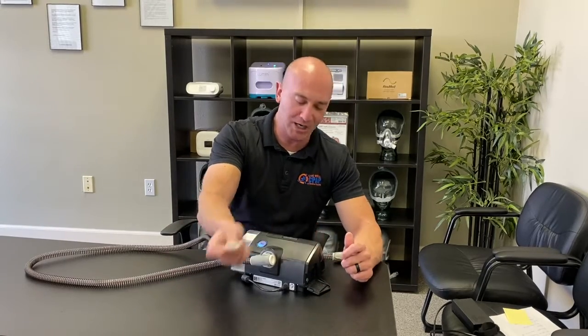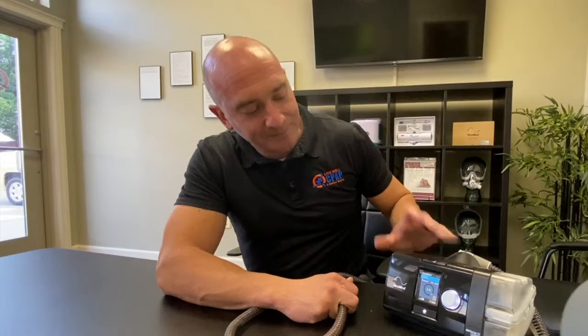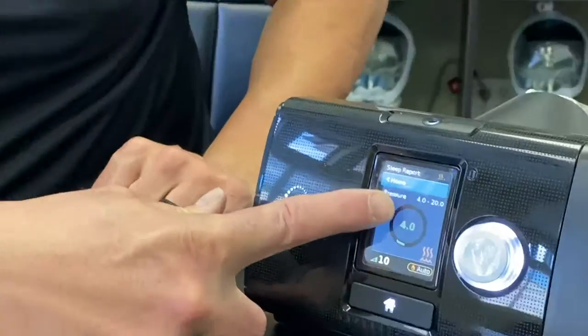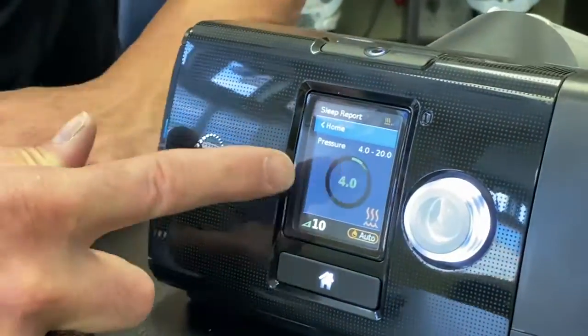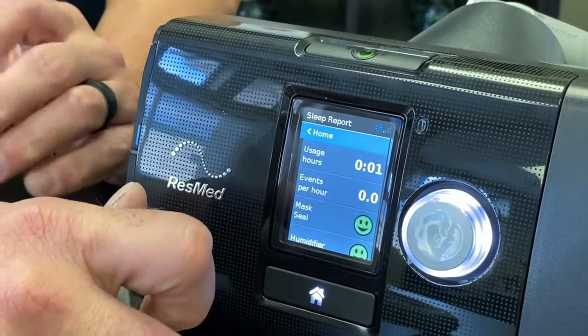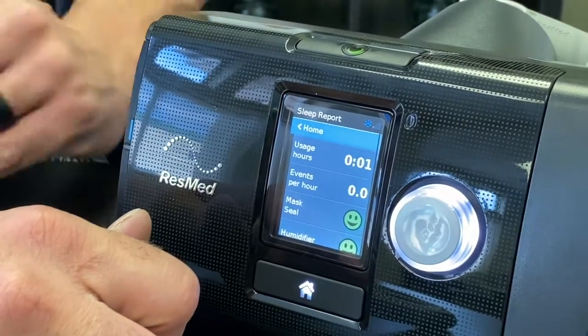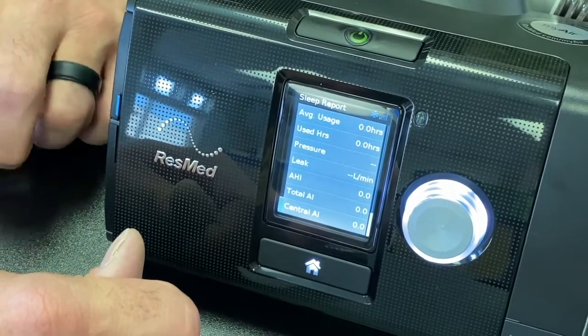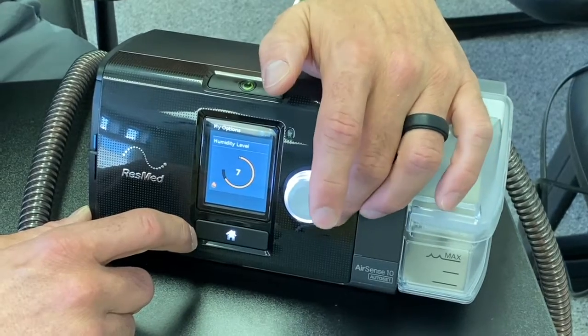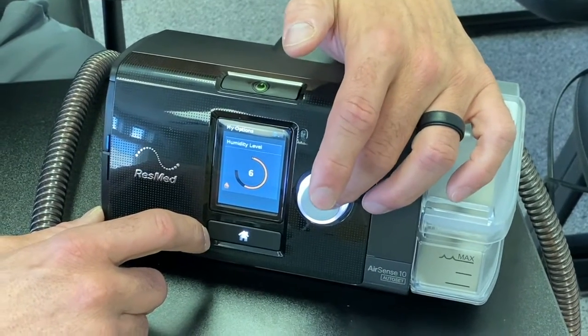Wash your humidifier chamber once a week and fill it daily. There's also a filter — pull it out this way and it pops open. I always send people home with hypoallergenic filters because they filter better and keep more dust out of the machine. The standard manufacturer filters can let a lot through, and dust buildup inside the machine can cause issues down the road. Check the filter every two weeks — if it's starting to look dirty with dust spots in the shape of the grate, replace it. It seats right on the door and snaps into place.